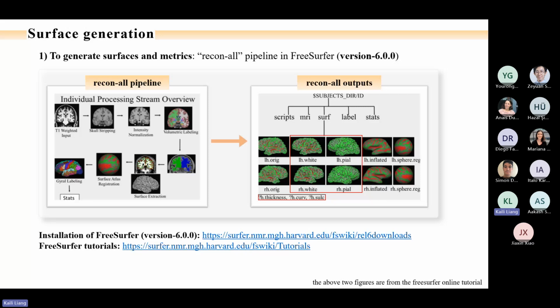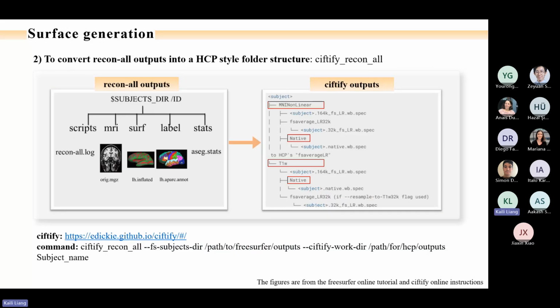You can see our files in the FreeSurfer outputs. They are not GIFTI files. FreeSurfer has its own file formats. You can only view this surface using Freeview, a visualization tool in FreeSurfer, and you cannot open these files in wb_view. So this is why we need Freesurfer2HCP.